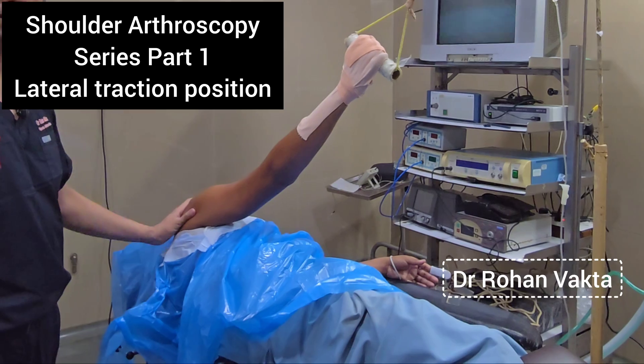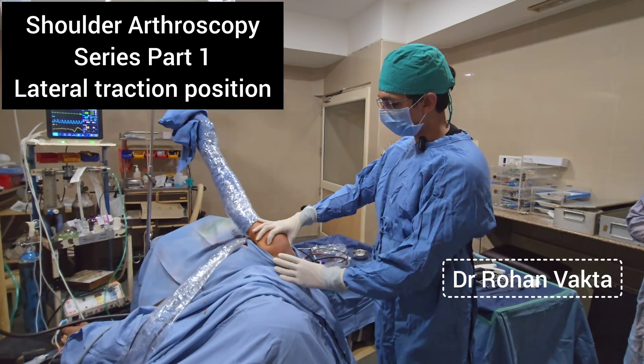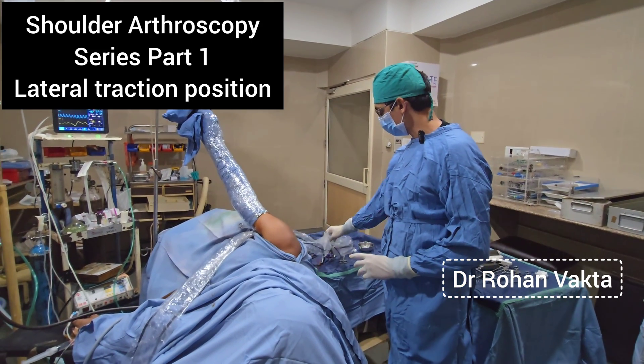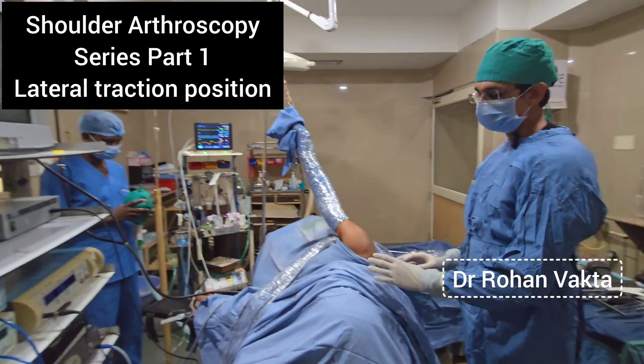For rotator cuff repair we also use a similar traction device, and for bankart repair similarly. The operative area is open and the entire hand is covered with a sterile plastic drape. The attachment is on the posterior side, and on the anterior side we have taped the drape.